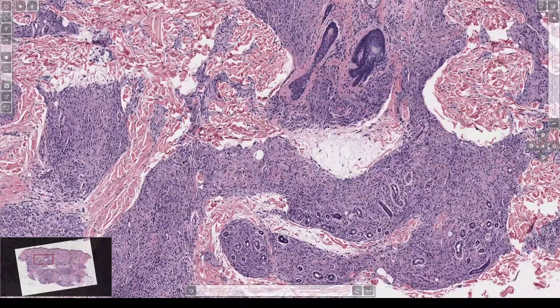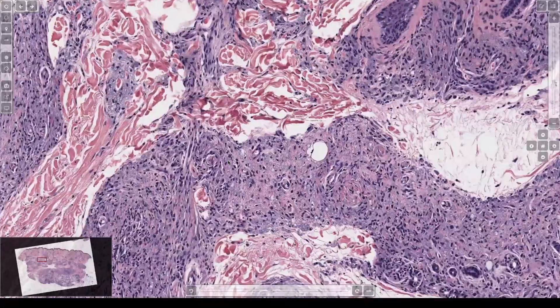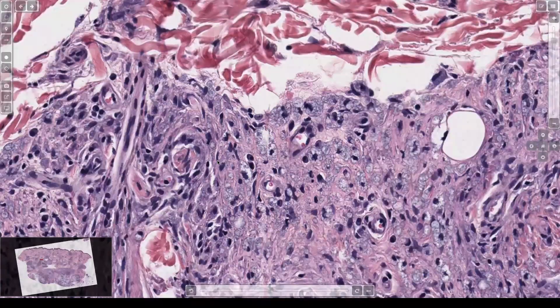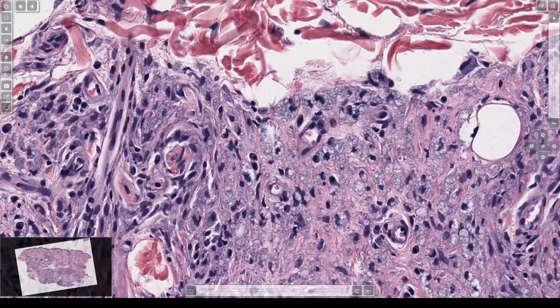So what stain do we do and what is the diagnosis? This is lepromatous leprosy. You do the Fite stain, which is a different form of acid-fast stain, and there will be a huge number — maybe two bajillion — organisms.